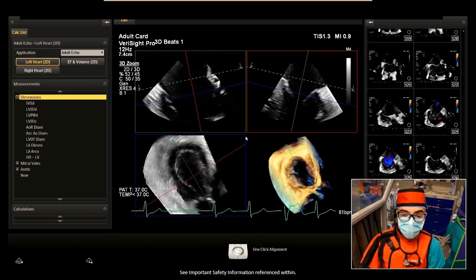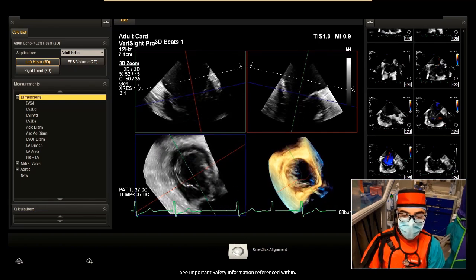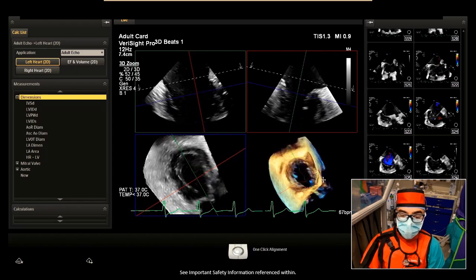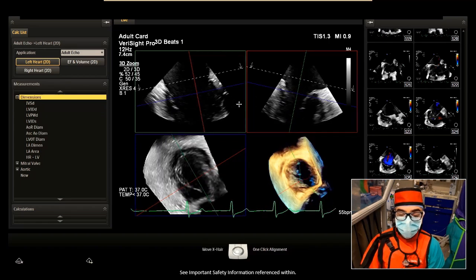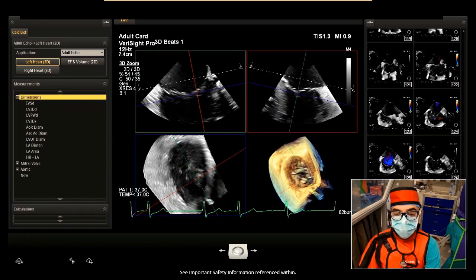Now it's really about ensuring the red plane is the alignment we like. If you look at the 3D rendering, it's a question of, is Gagan happy with the 3D rendering and the way the red planes align? So Gagan, what are your thoughts on that? Looks really good. And so that means this is your grasp right here. This will be your septal. This will be your anterior leaflet. Yeah, and that's all with MPR, just straightforward MPR, not utilizing 3D navigation.